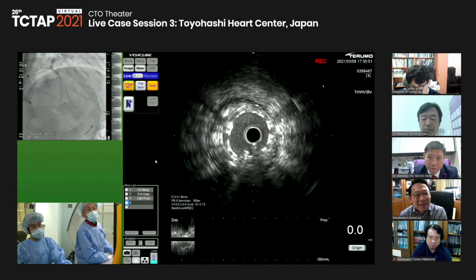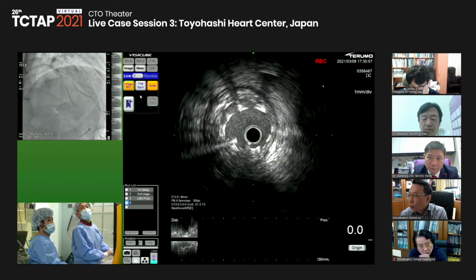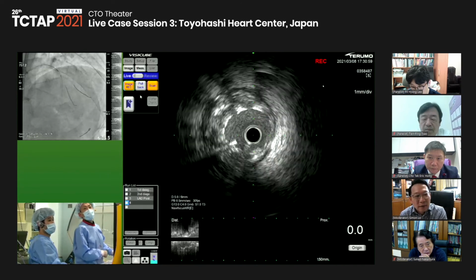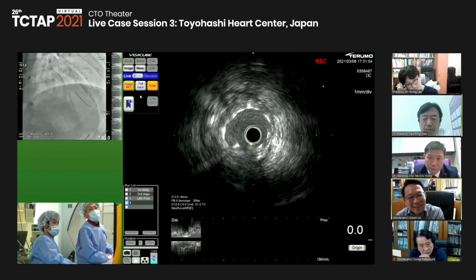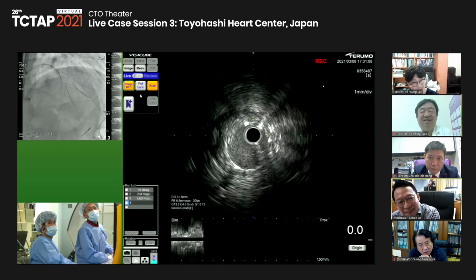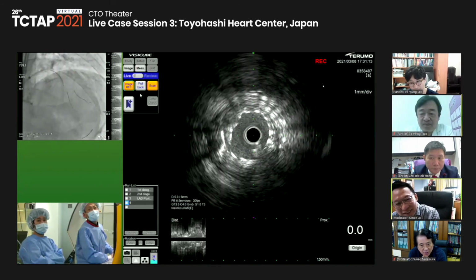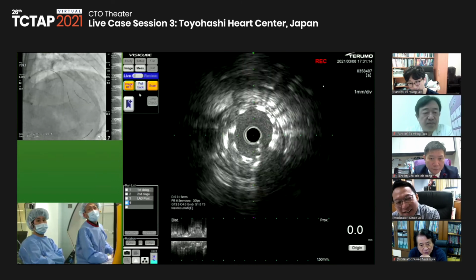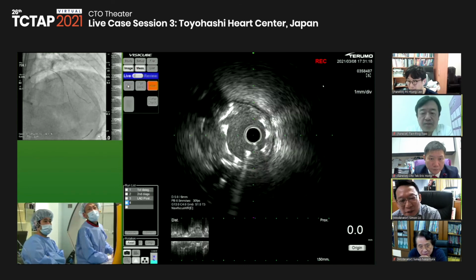Correct. So which is first is better? Final kissing inflation or the POT? Yeah, I'm not a specialist of bifurcation. Could you tell me? Dr. Nakamura, please advise. We can't hear Dr. Nakamura.